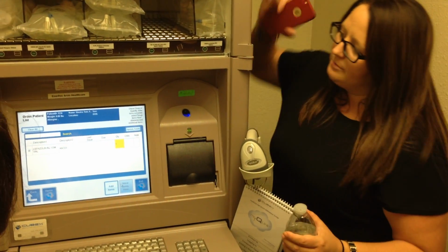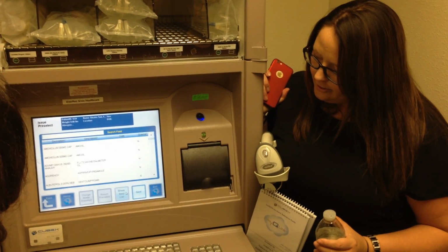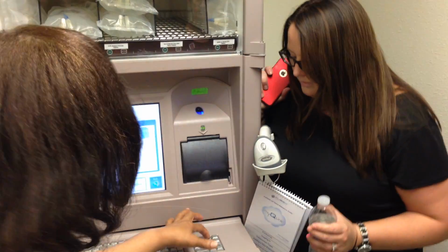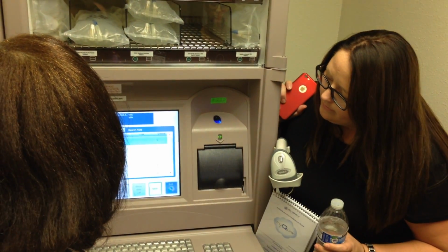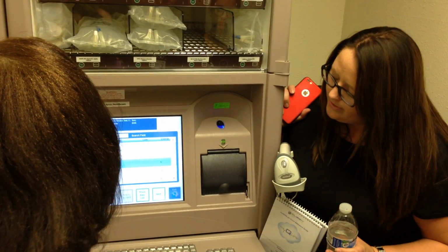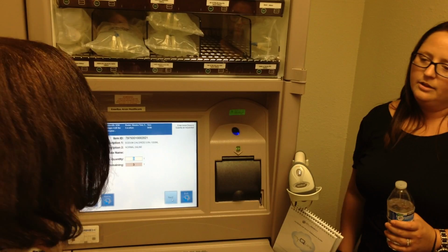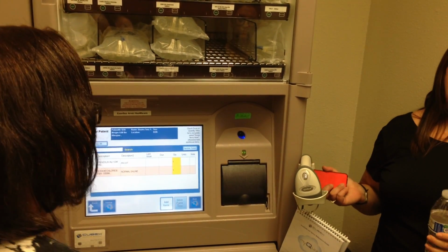We're going to add one more item because I want you to see how this works. You're going to type in 0.9. And then we're going to grab the 1,000 ml bag. I think it's the third item down. Third one. Okay, and then hit next. Declare how many you want. One, yep, and then hit next. Okay, so that's anytime you guys need to add an item.